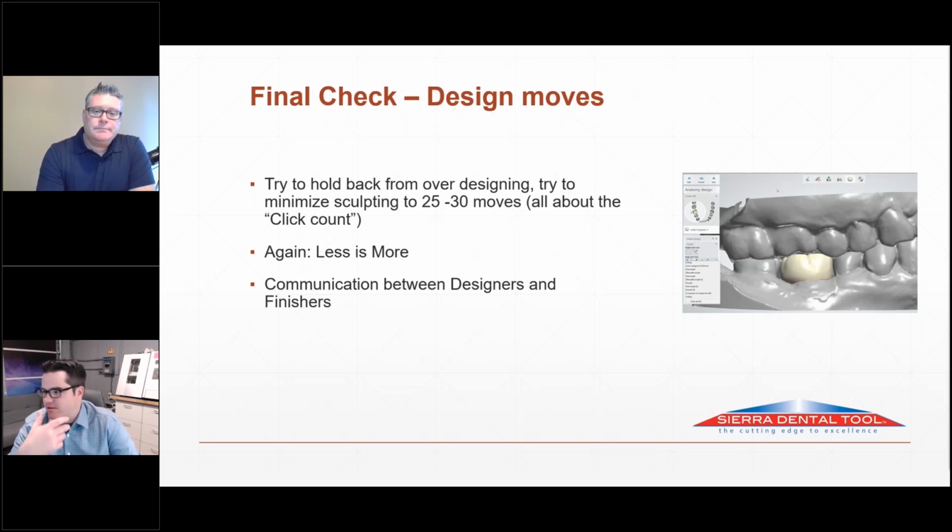Yeah, and that's a theme throughout digital: just learn the tools and be aware of them. I've encountered people who have difficulty just using Windows, the computer itself, and I recommend making a point of learning that stuff. Know how to right click, know how to copy and paste, know some of the basic shortcuts. Because if you're staring at a screen all day long doing this, every single little thing like that you can learn is going to help you and keep your stress level down.